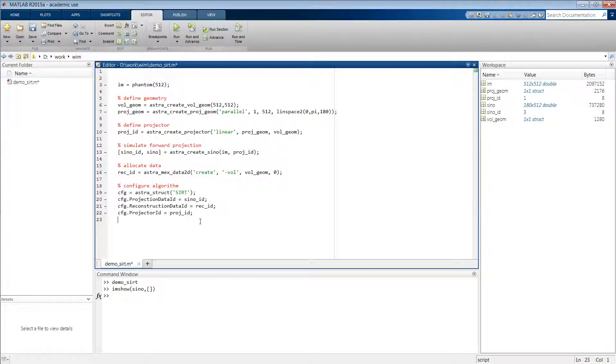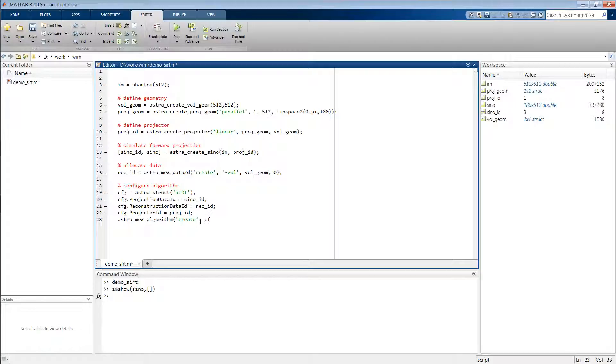And then also we have to specify the identifier of the projector object which we've defined here. And then with that done we can now actually create the algorithm. So we type astra_mex_algorithm('create'), this configuration struct, and then this returns again an identifier to an algorithm object.